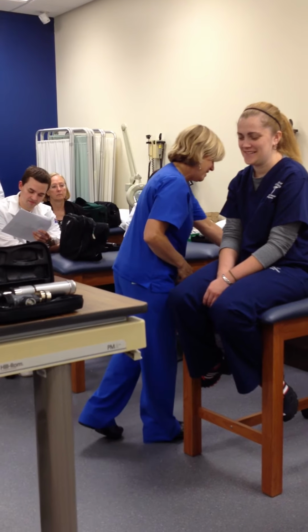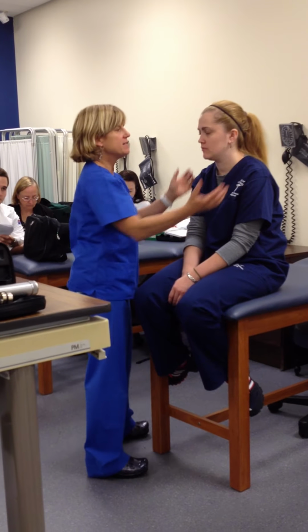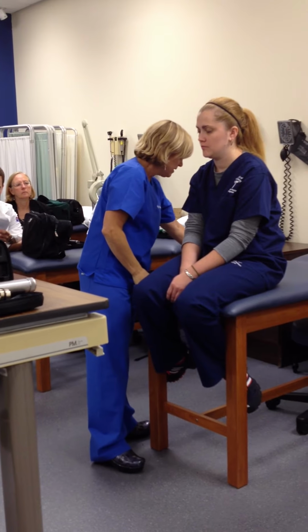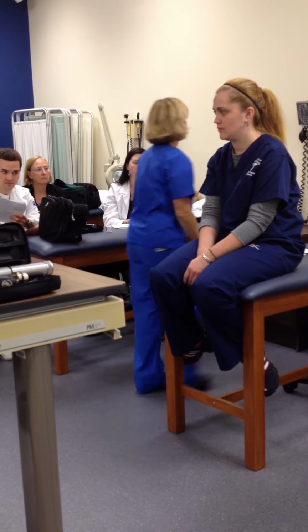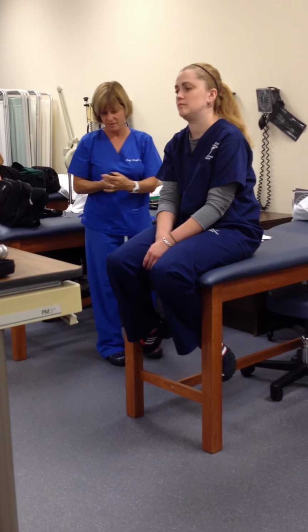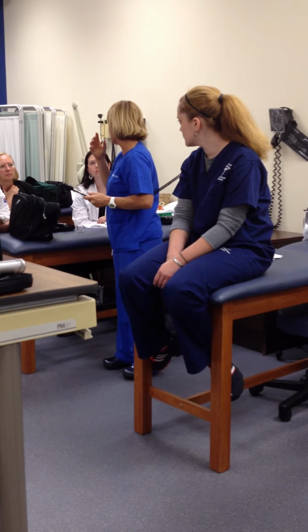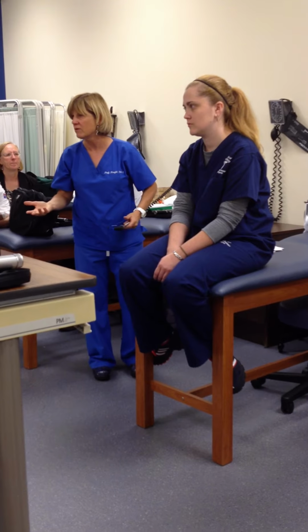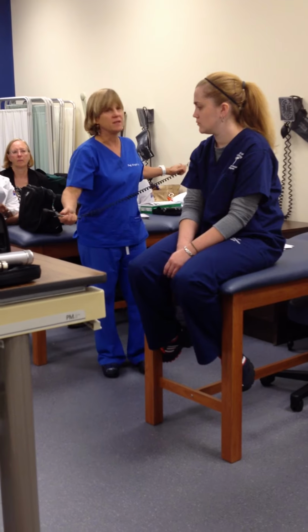We are very sensitive. And then we're going to go ahead and palpate. Could you close your eyes? I'm just going to check the intraocular pressure, and you just palpate on both sides and see if it's similar. What do they do if our patient has contacts? You can ask them to look down a little, and you can press gently, as long as their lids are closed, and I think we're okay. Those of you who wear contacts, would you agree? Pretty much, when we look down, we keep them in there, okay?